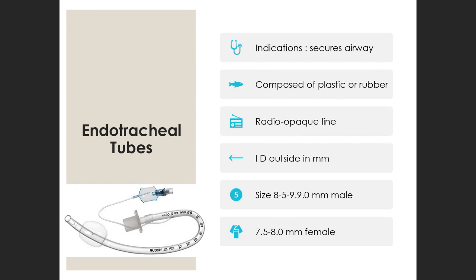And we can go. Some things are not going to make quite as much sense as they normally would, because you just are not in the clinical space just yet. But as I say, of all the groups you have the greatest advantage because you're doing a lot of your lectures, not just in anesthesia, but in the other clinical specialties, quite close to when you're coming to turn in person. All right, so let's start off with endotracheal tubes.